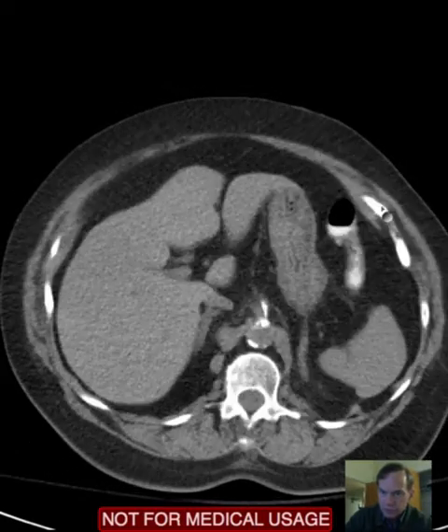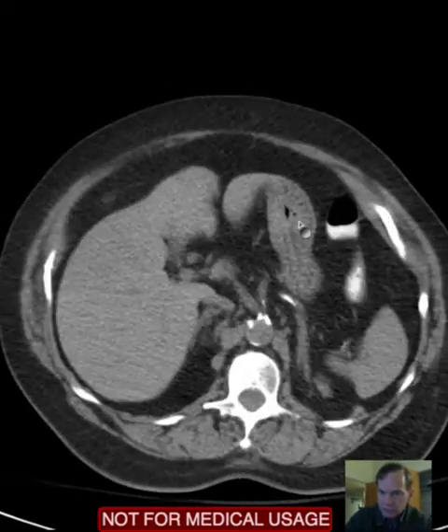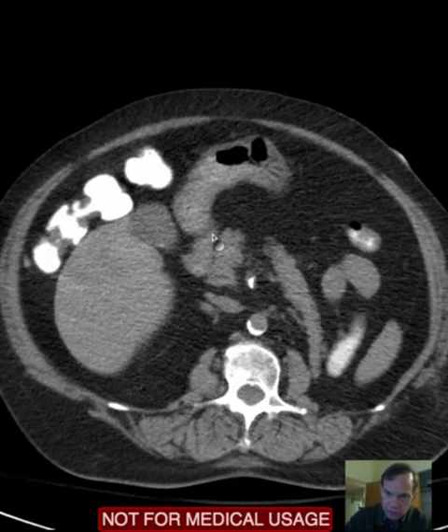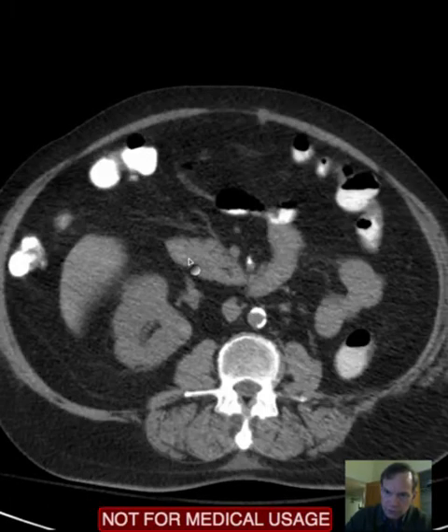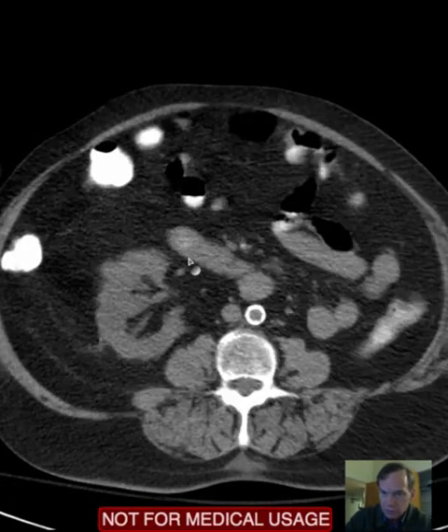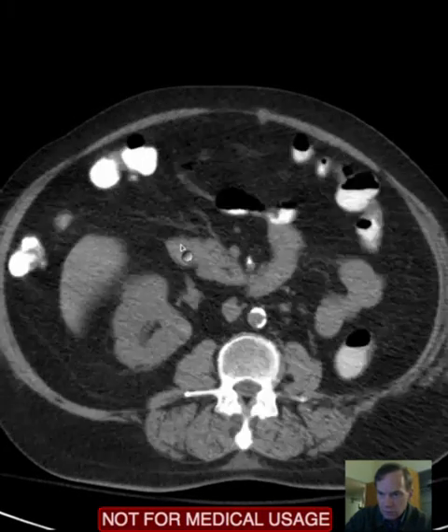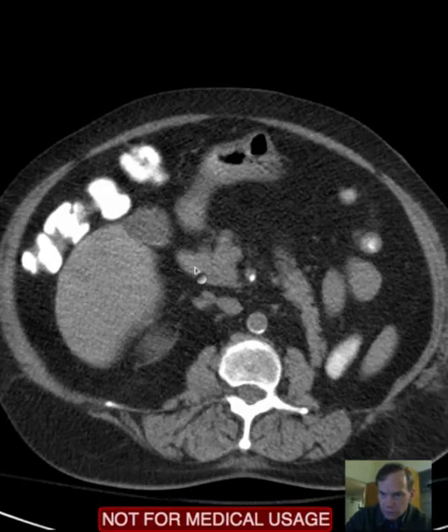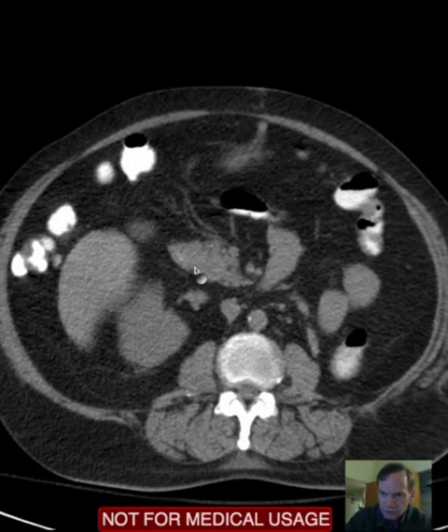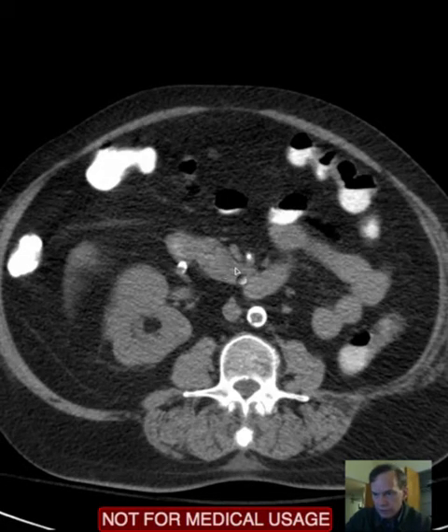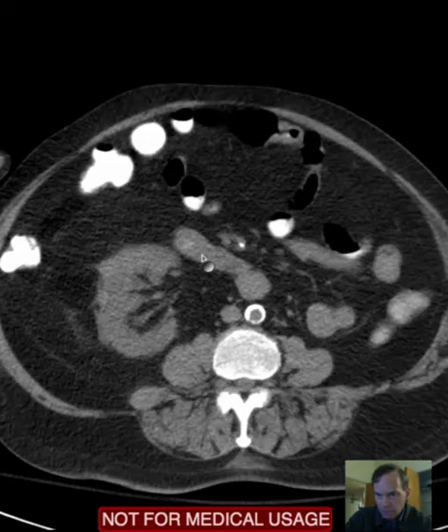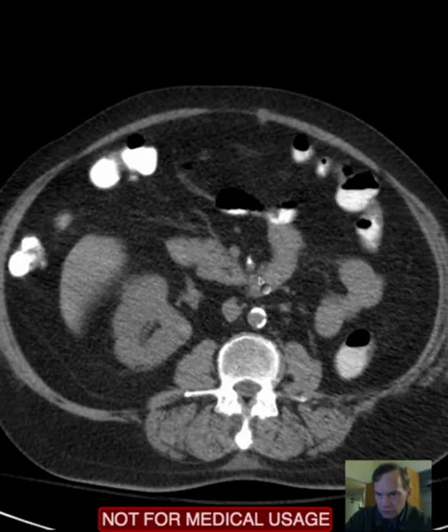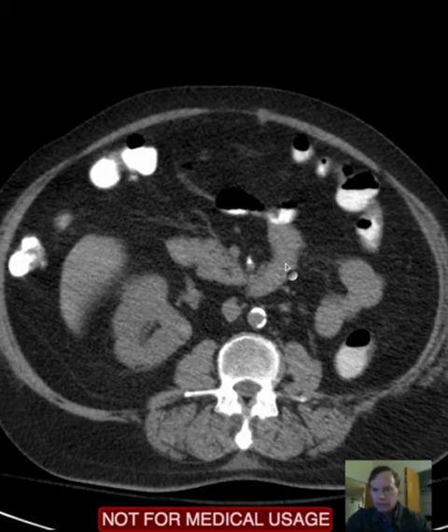Another way to evaluate bowel is to start proximally and follow it distally. Here's the stomach, which should empty into the duodenum — first into the first portion of the duodenum, the duodenal bulb. The bulb is right around here; it's very small in this case. Then you have the second portion of the duodenum, which is right next to the pancreatic head. Then that turns as the third portion of the duodenum, and then courses superiorly as the short fourth portion of the duodenum.